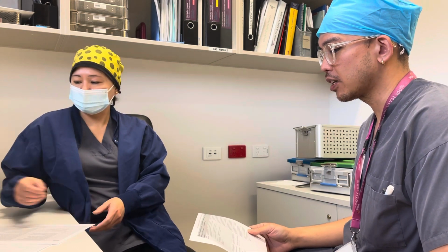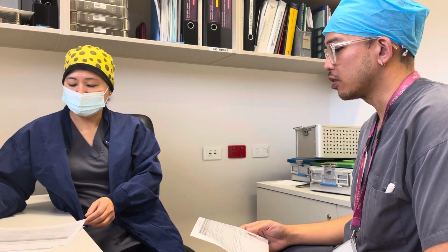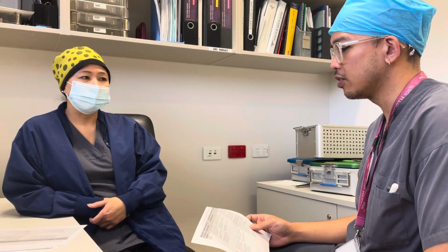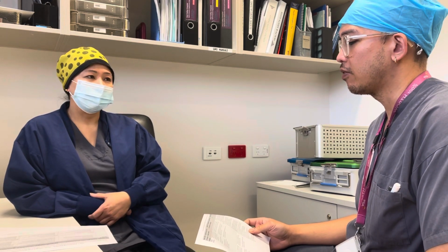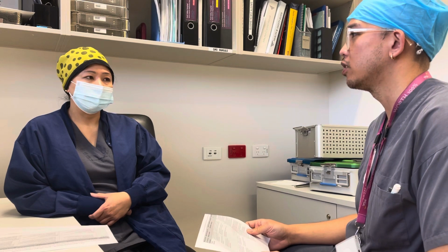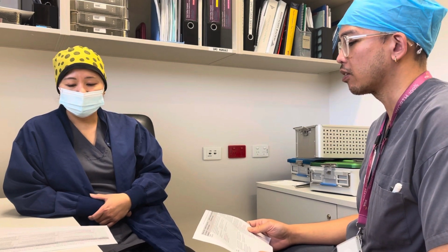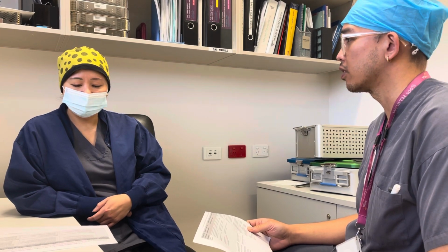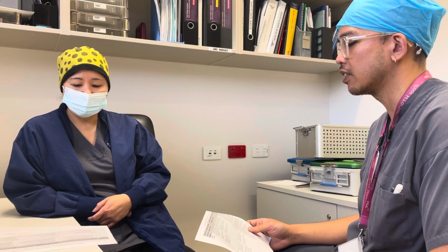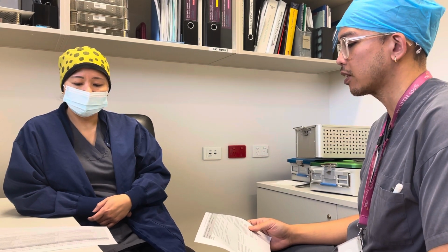So first we're going to discuss ASNZS 4187 2014. The standard is used to specify the requirements and practices necessary for the effective and safe reprocessing, storage, handling, and transportation of reusable medical devices in human healthcare in various health service organization settings. These HSOs include hospitals, general dental, and podiatry practices.